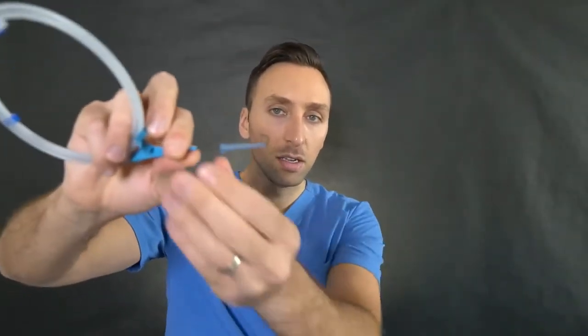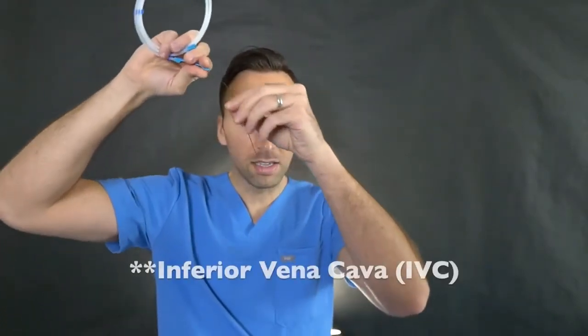The first thing we would do is use our ultrasound machine and take a small needle — this is an 18 gauge needle. We usually access with a 21 gauge micropuncture and access the internal jugular vein. Once you gain access with an 18 gauge needle, you can directly place the guide wire — the J wire — threading it through the needle and down the entire length into the IVC.